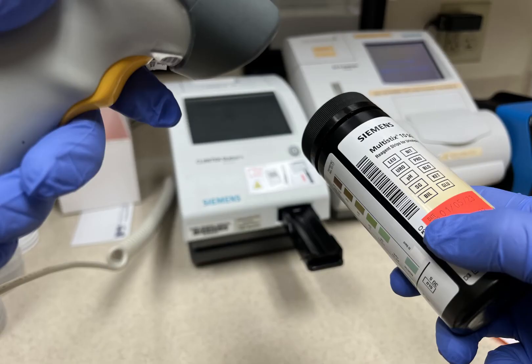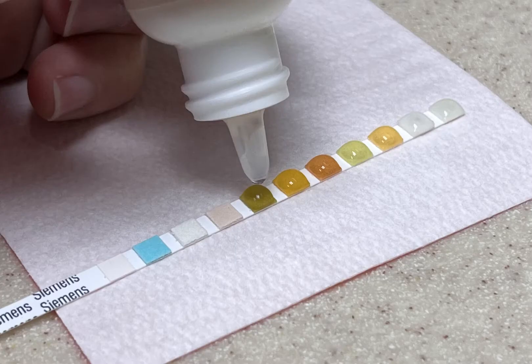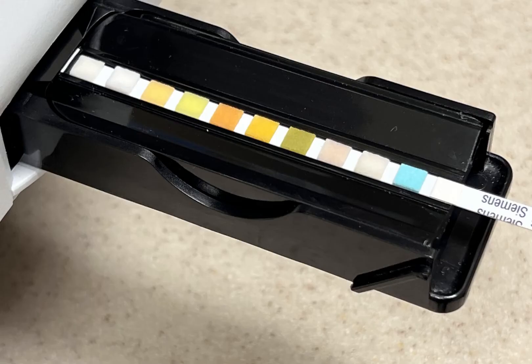Click on enter new lot and expiration date. Scan the barcode on the strip lot file, then click enter. Remove the strip from the file and apply the control sample. Tilt the strip and tap down to remove excess control sample, then place the strip in the channel, making sure it is straight and all the way in.